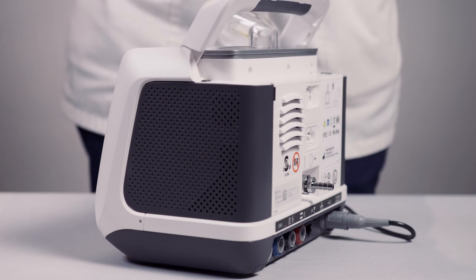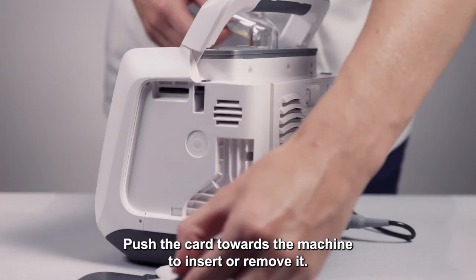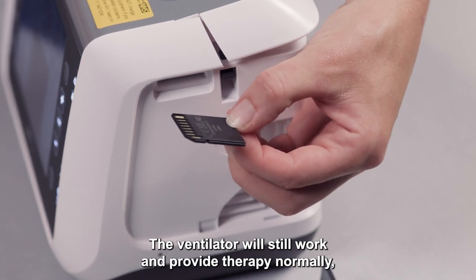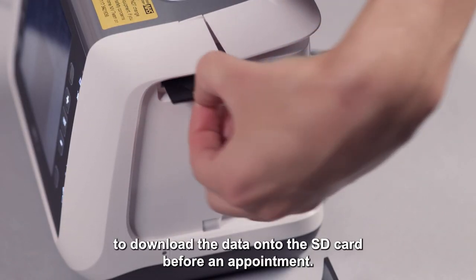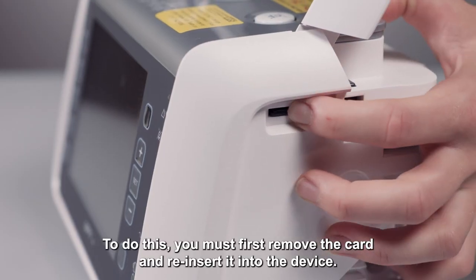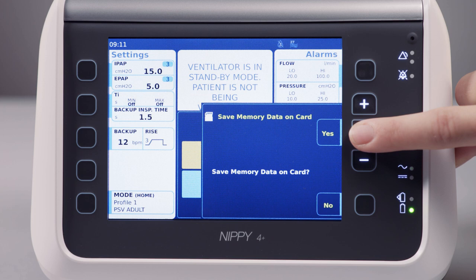To access the SD card, lift the carry handle and press the button underneath. Push the card towards the machine to insert or remove it. The ventilator will still work and provide therapy normally whether an SD card is present or not. You will be asked to download the data onto the SD card before an appointment. To do this, you must first remove the card and reinsert it into the device. A message will appear on screen asking you to save memory data on card. Select yes.